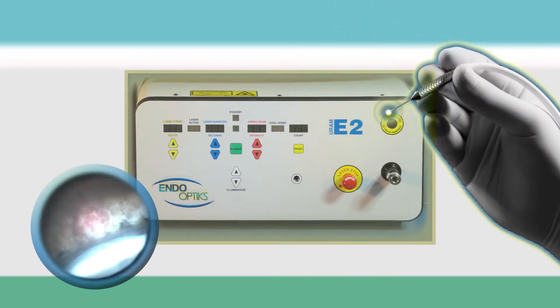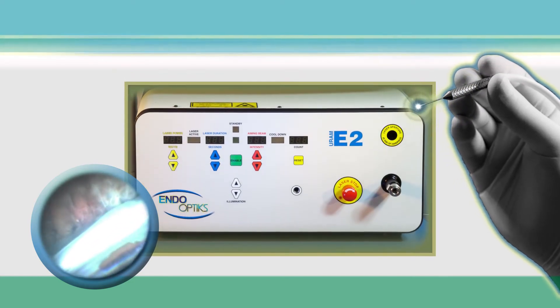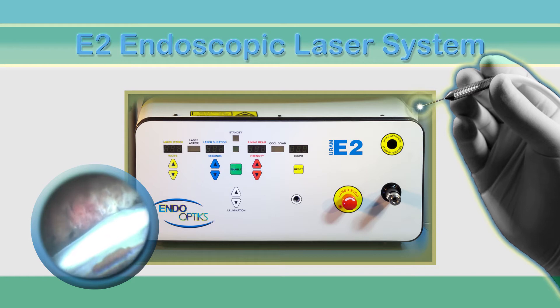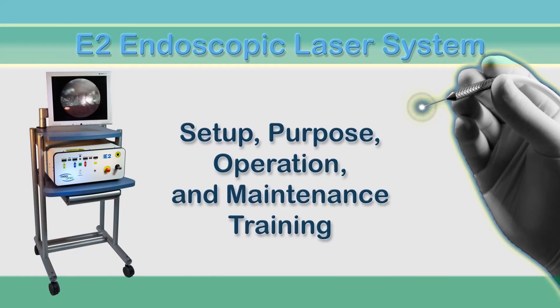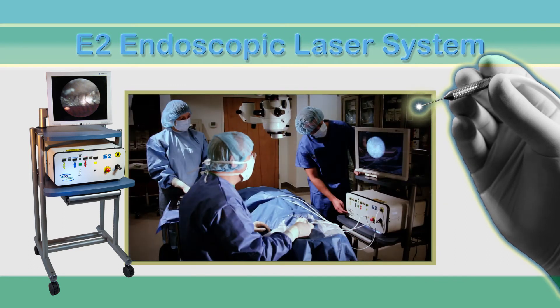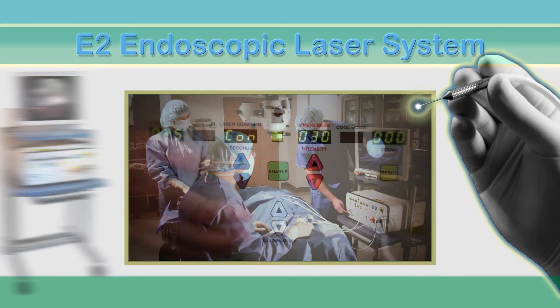Hello, and welcome to the EndoOptics in-service video for the E2 Endoscopic Laser System. Our objective is to provide complete instruction for operating room personnel on setup, purpose, operation, and maintenance of the E2 console and microendoscopes. This video is presented in the following sections, which can be accessed individually as needed.